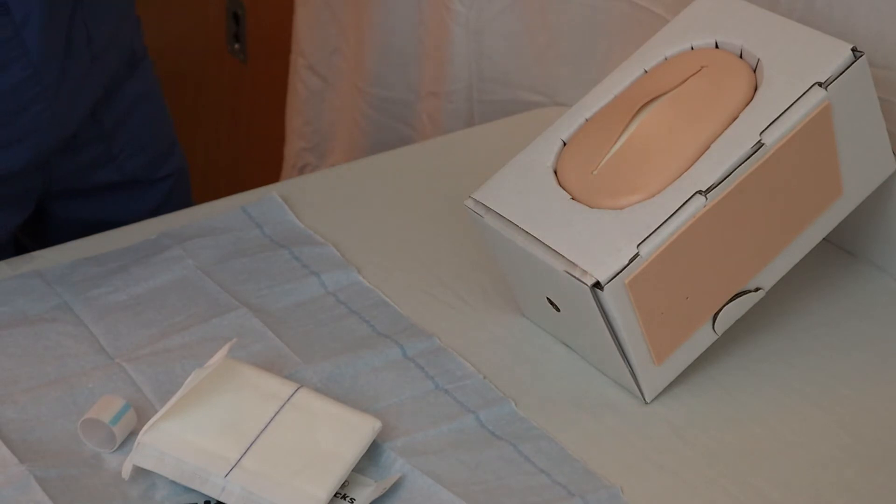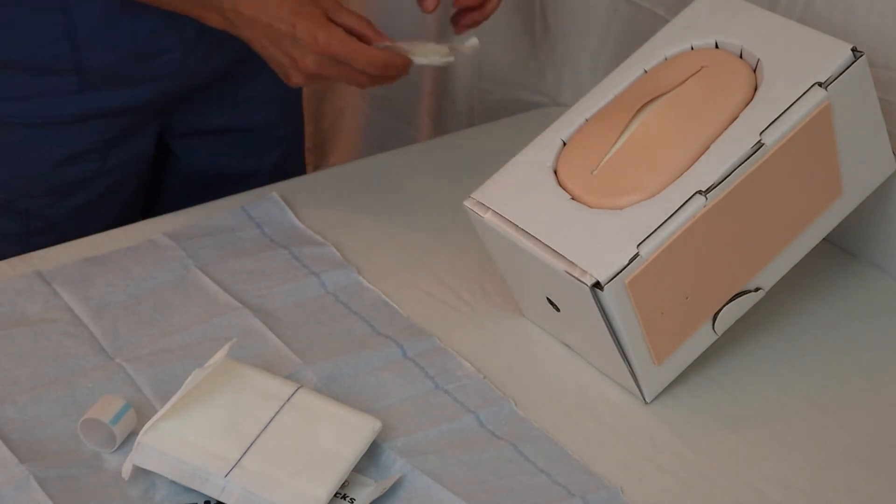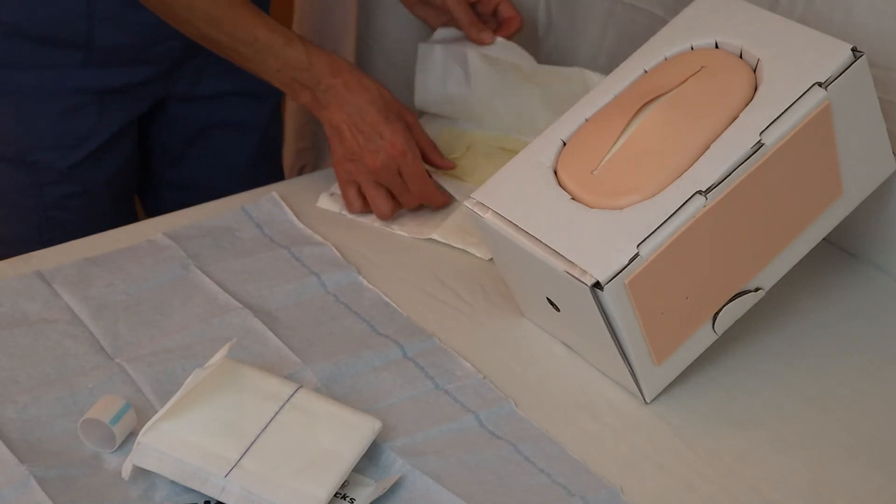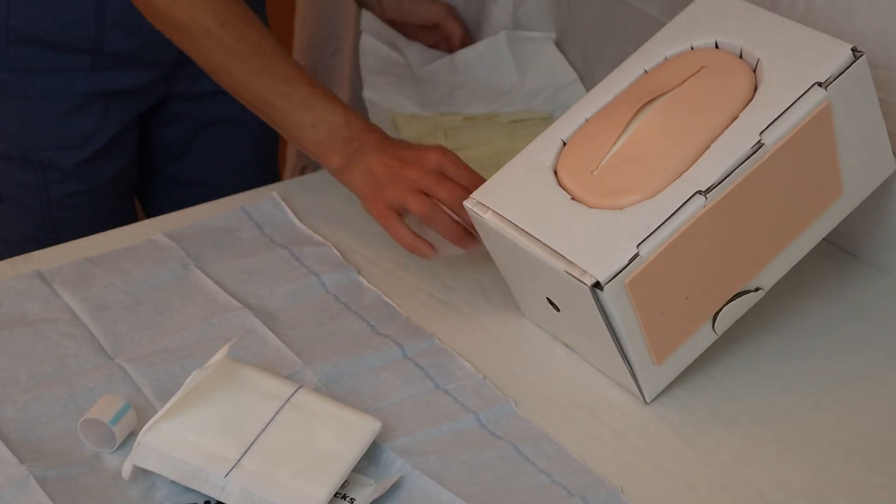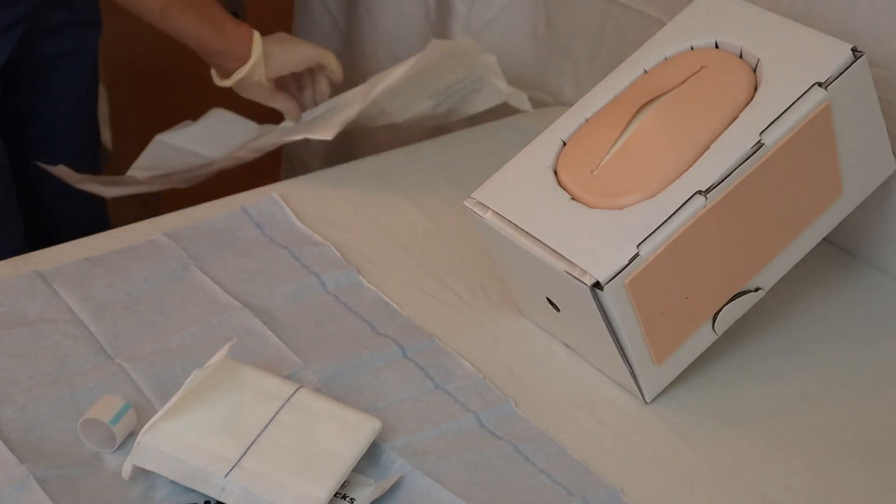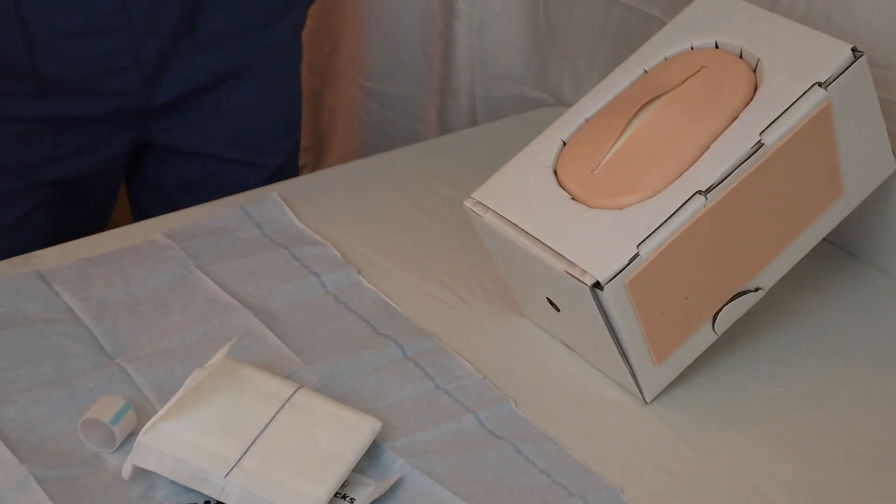Now that I got my sterile field all set up, I'm ready to don my sterile gloves and I'm going to do that away from my sterile field. I don't want to put anything on top, I don't want to reach over it. I have a separate video on how to don sterile gloves properly. And then I can just take the wrapper here and be careful and stay away from the sterile field and throw it in my bin.